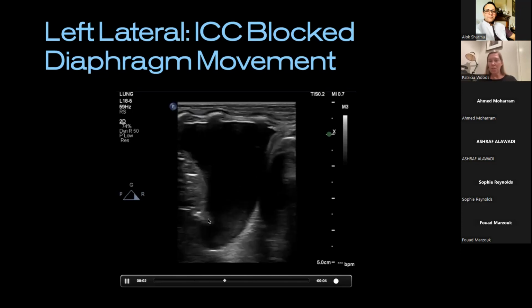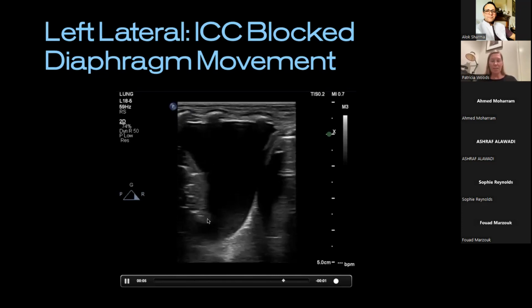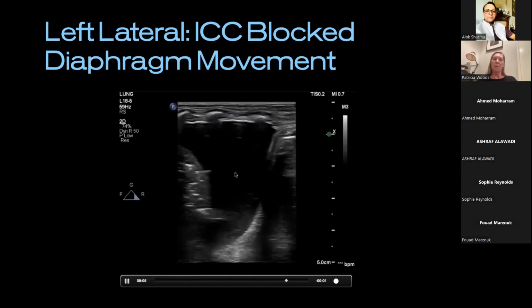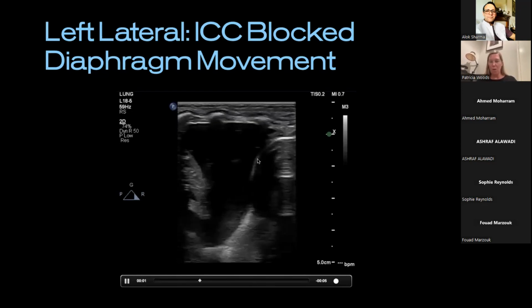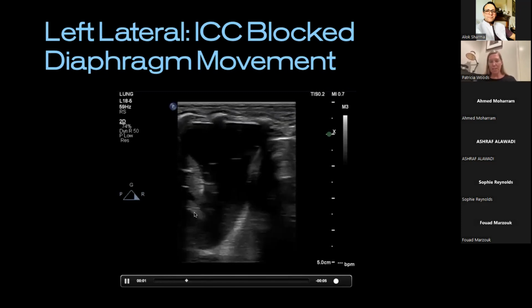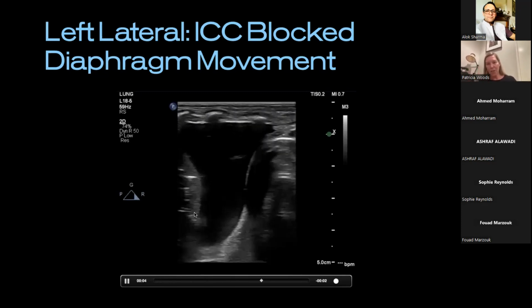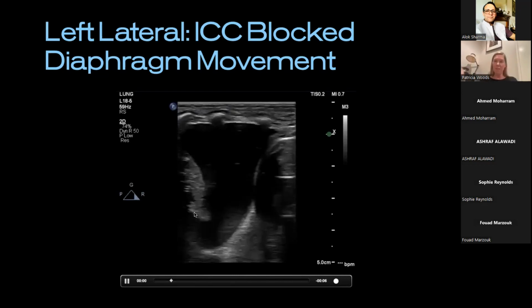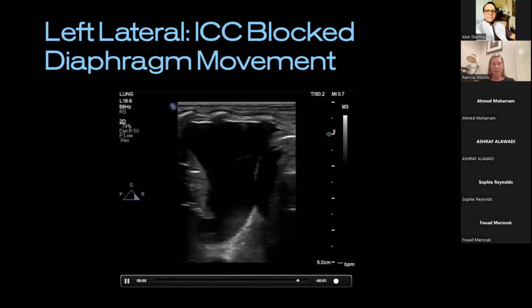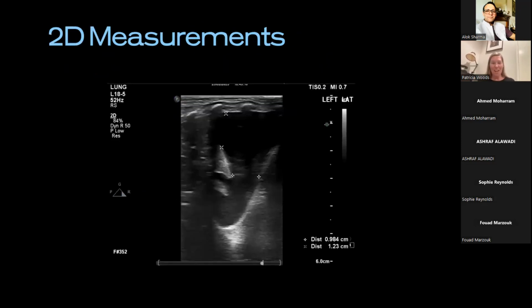Okay, so really being able to show my colleagues at the bedside, I think this effusion is really significant now, probably due to a blocked catheter, but let's look at this baby. We need more breathing support. We need to get this drained, probably, when you start looking at the amount of fluid accumulating and how it's really coming posteriorly, laterally, and superiorly over the lung. It's got nowhere else to go, it's starting to compress down on it. Again, measuring here, the measurements themselves weren't that exciting. I was just more excited about the images. But anyway, you're going to put it into clinical context and ask will it benefit your patient?